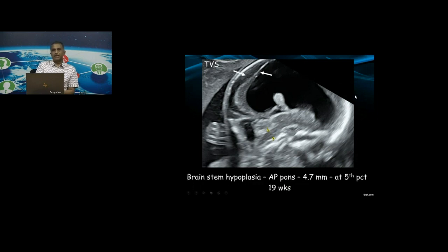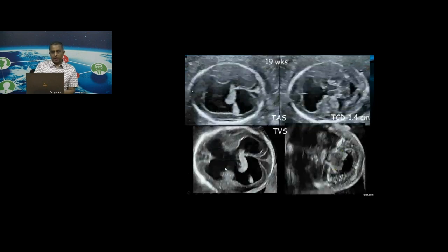the direct mid-sagittal section. You will also agree with me that there is one lateral ventricle which looks a little bigger, the other lateral ventricle looks a little smaller. So when I go strict mid-sagittal, I'm not going to cut supratentorial mid-sagittal, I'll be cutting through the bigger ventricle, and that's exactly what has happened over here.